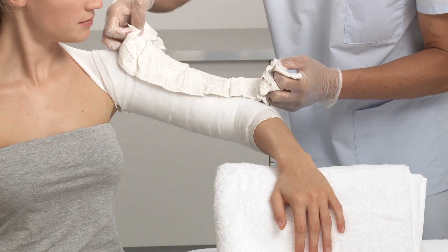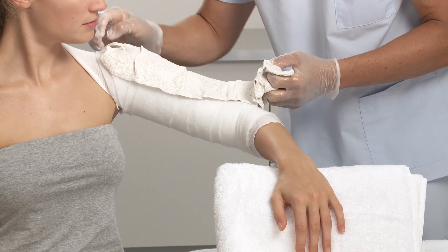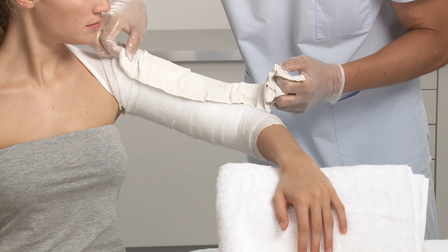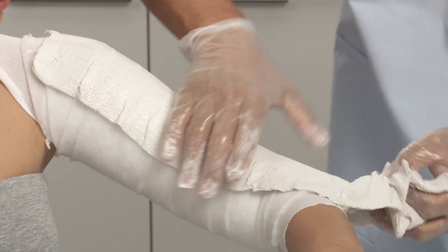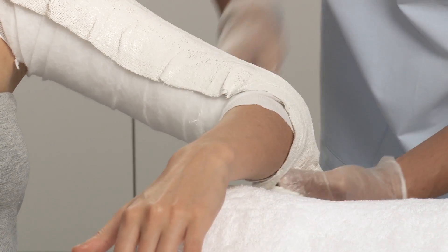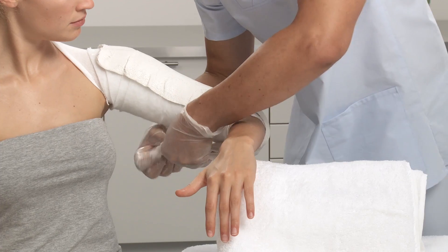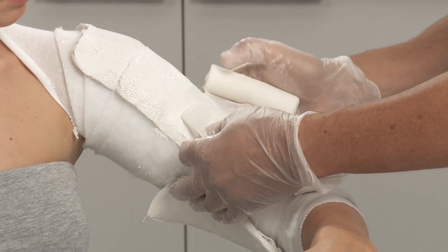Apply onto the patient's upper arm, wrapping the end over the elbow and back up the arm to form a U-shape. Fix with a bandage.